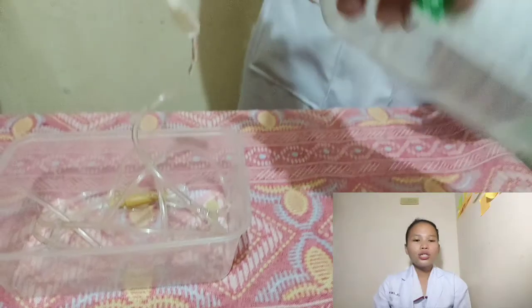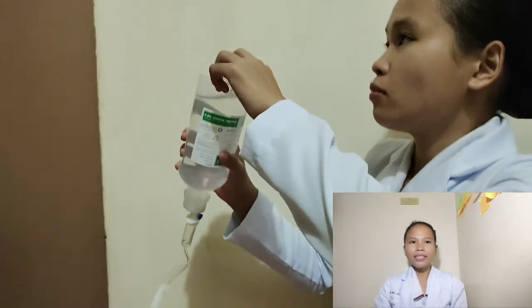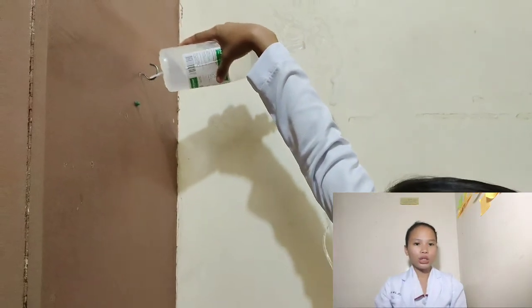Place the client in a supine or low Fowler position in bed. The supine position permits either arm to be used and allows for good body alignment. The low Fowler position is usually the most comfortable for clients. Suspend the bag or bottle of solution on the IV stand. The fluid height should be 18 to 24 inches above the level of the vein. This height is sufficient to overcome the venous pressure.